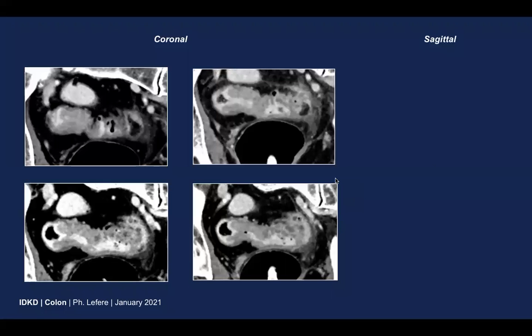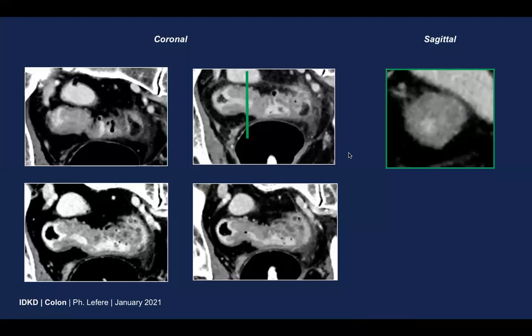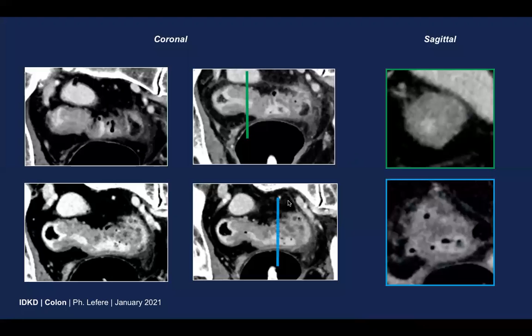Coronal images confirm the same imaging findings. It is also interesting to perform a sagittal reconstruction to see the homogeneous soft tissue wall thickening gray aspect, somewhat comparable to muscle density. Whereas a sagittal reconstruction of the other zone clearly shows the hypodense aspect, with hypodense submucosa, presence of diverticula, and some infiltration. No diverticula in the second zone.